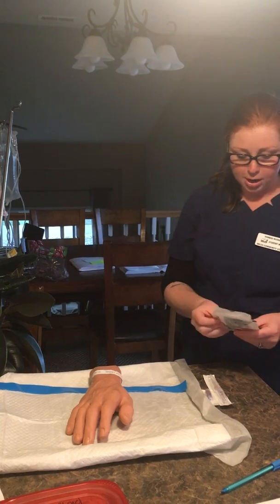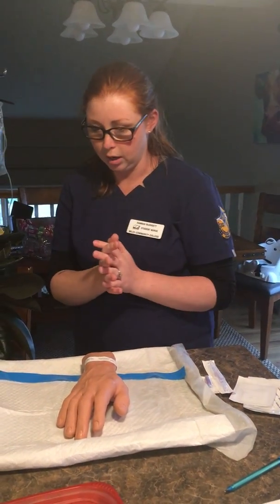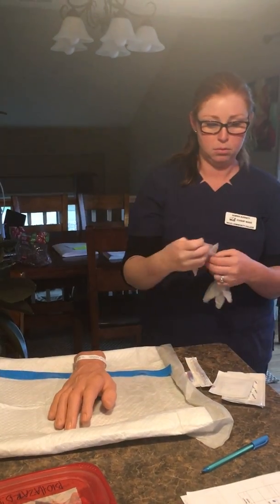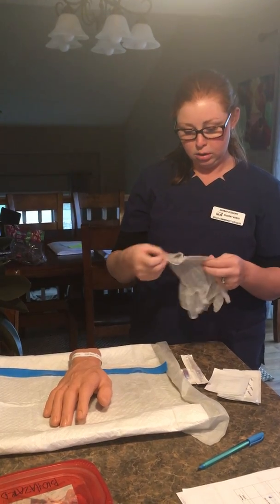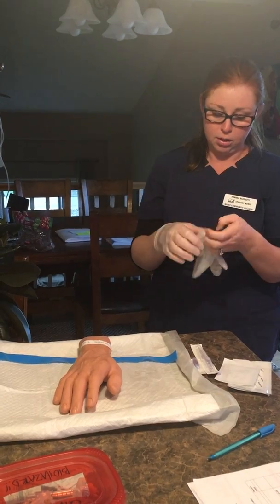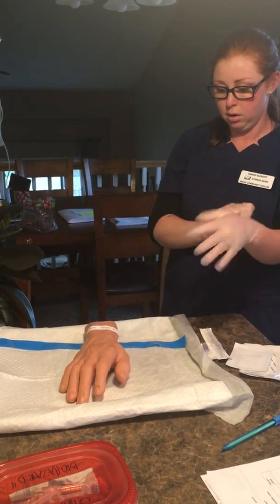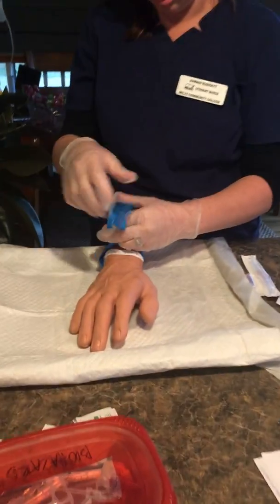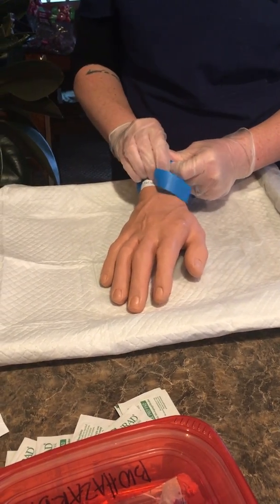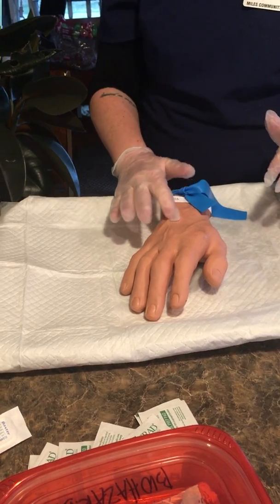And once I have all my supplies gathered, I can go back to my patient, wash my hands again, and I'm going to go ahead and throw some gloves on here. I'm going to locate my vein again. Go ahead and place the tourniquet. Nice and snug. But again, not too snug. So I have my vein here.